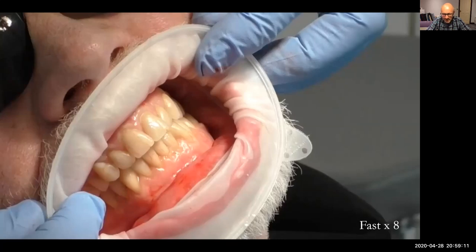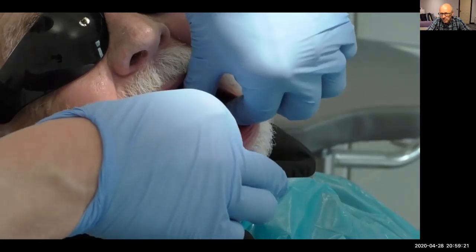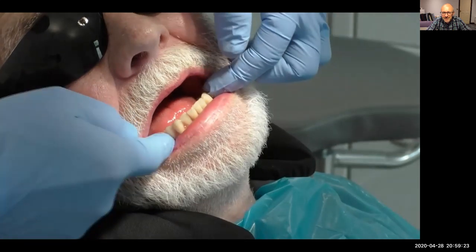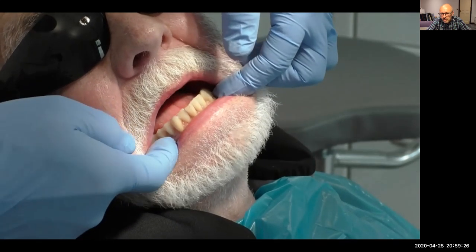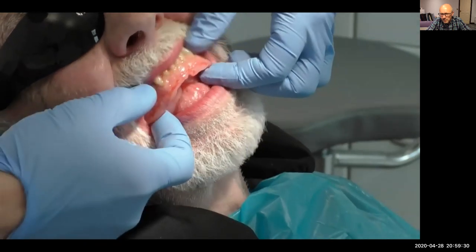And I'm going to take out the Optricard now. And I had great suction on this lower. This is a full lower denture. This is the suction I had, if you turn your sound up on your devices. But you can see I'm really pulling on that with my fingers, and out it comes. There's no implants or nothing on that. It's just purely the shape of the denture.